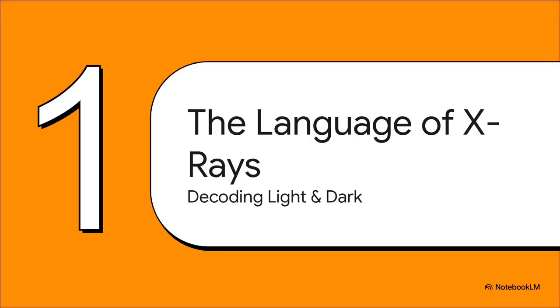Okay, so first things first. We've got to learn the basic language here. It's kind of like learning your ABCs before you can read a book. And in the world of X-rays, that alphabet is all about two things: light and dark.